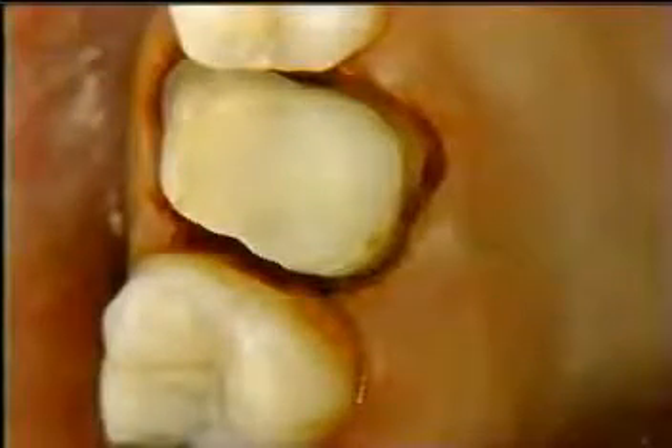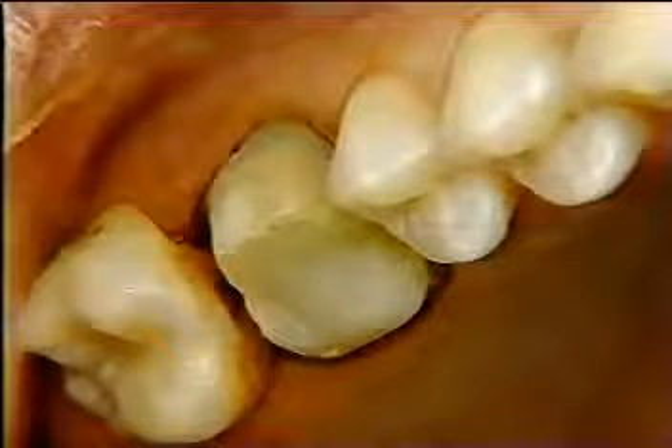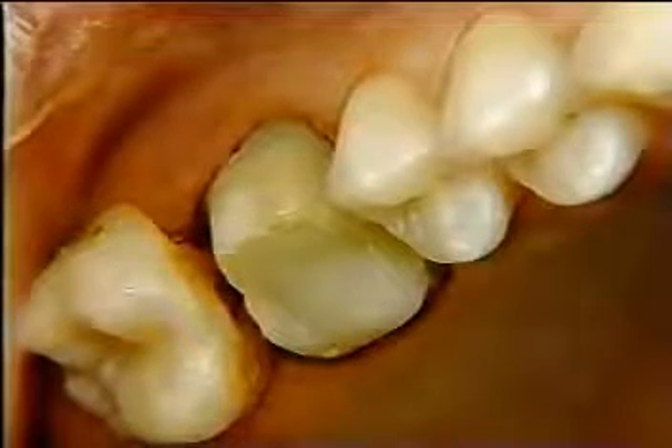Sometimes the gingiva appears dark after the infusion process. This is due to iron precipitated coagulum in the tissues. This discoloration dissipates within 24 to 48 hours after the temporary is placed.